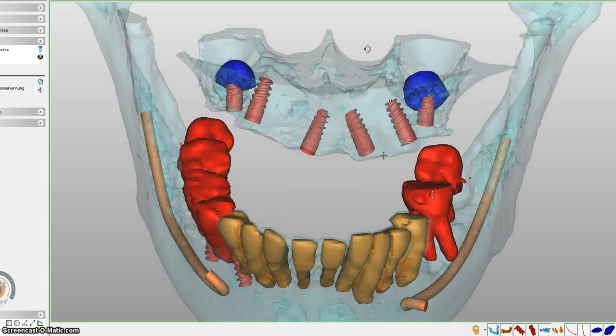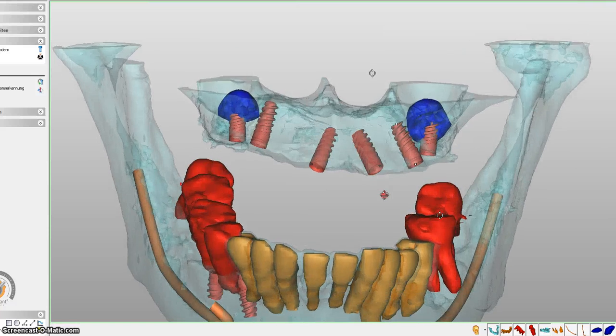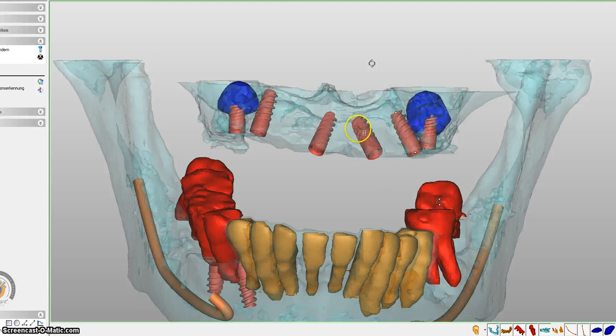Okay, all right. There's a third option for the upper jaw where we place only 2 implants. Make a removable denture, just like the first option I told you about, and 2 of those implants have little retentions. They're alpha lock retentions. Katalin can tell you about those as well. They are like little pins, you have something like this on your jacket. When you close your jacket, you have these little pins that you can push together, and then the jacket keeps closed. That's how you can imagine it.